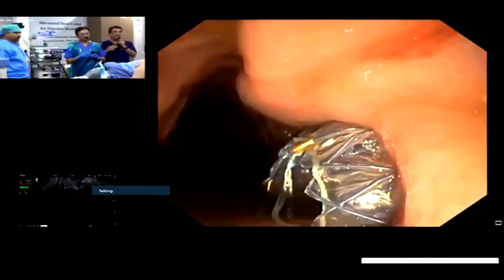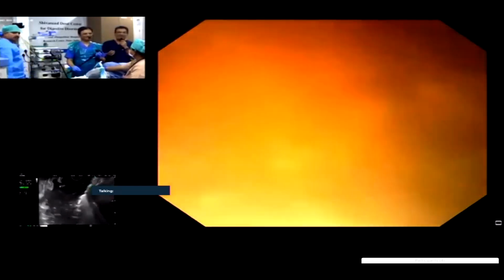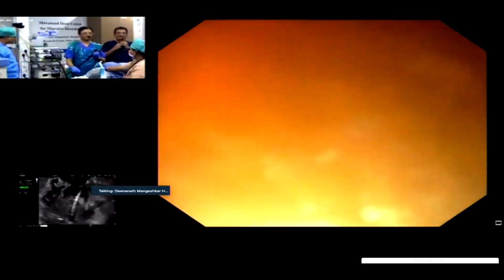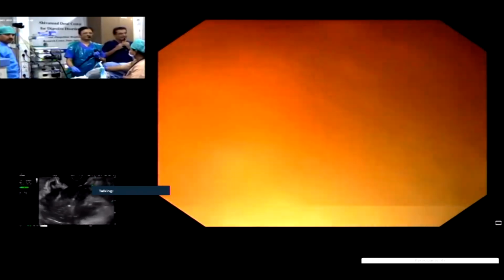So we don't have an experience with hot Nagi so far. It is a good stent to use. I definitely will agree, because it will save the number of exchanges of the instrument. But again, for a fluid collection, this has become such a standard procedure that I am a little bit reluctant to change policy. This is more of a personal preference in our department rather than anything else. Definitely, not a problem.